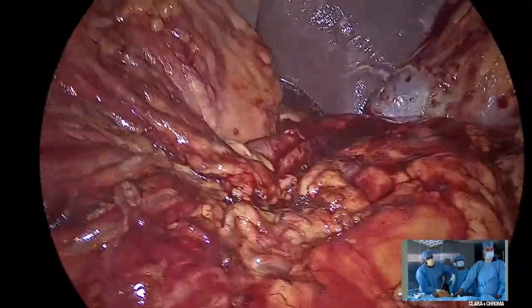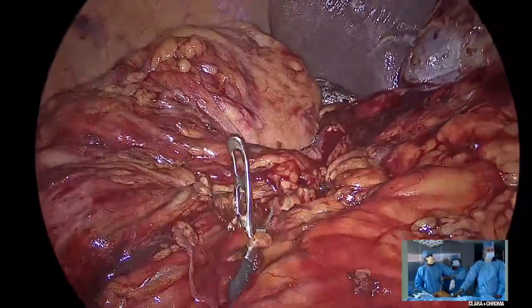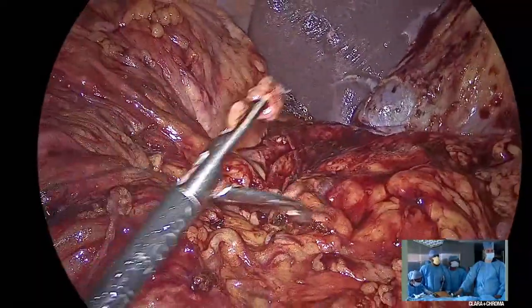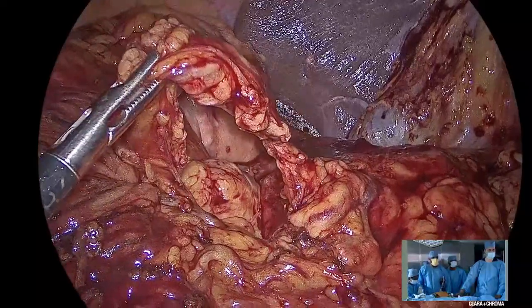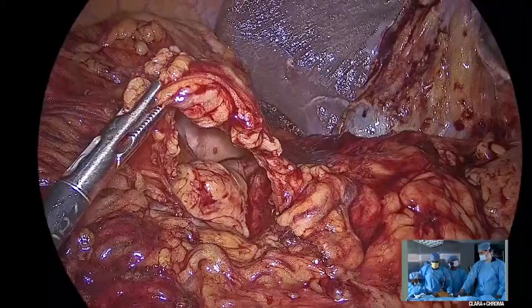So this is, you know, an area where an energy source can actually increase the bleeding rather than decrease the bleeding by damaging the thin walls. Because these are all low pressure systems. These are all branches of the portal vein, but a very low pressure system. And we have seen a very wonderful way to hemostasis in this area. Very well done, Dr. Jameel.